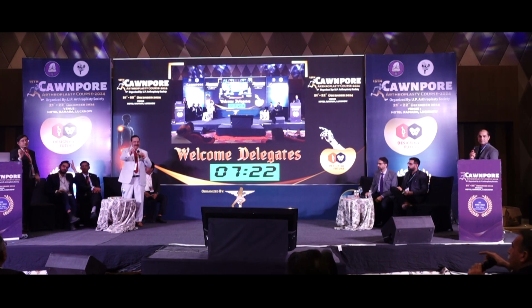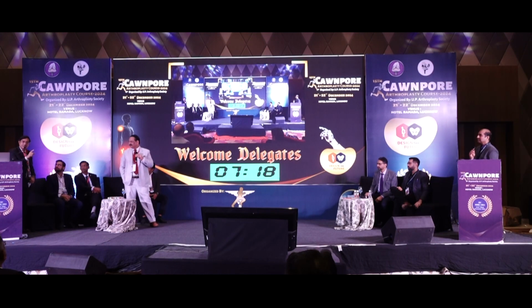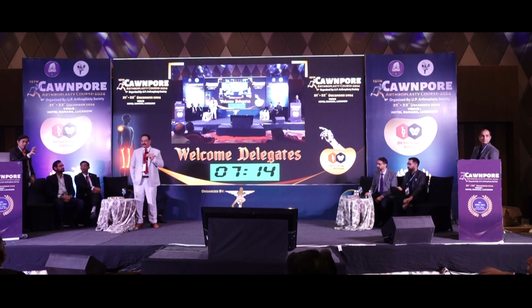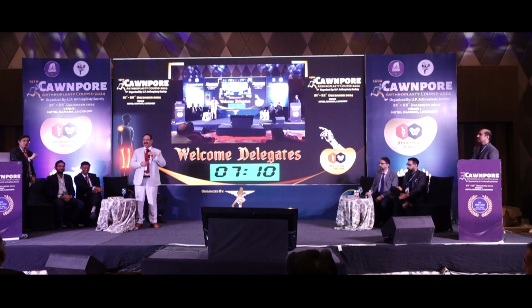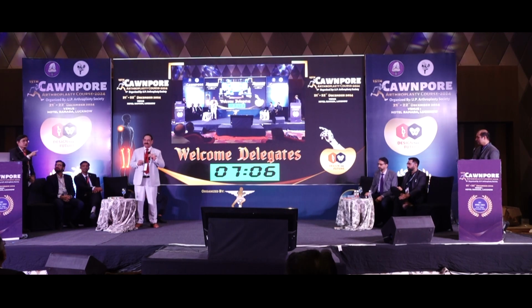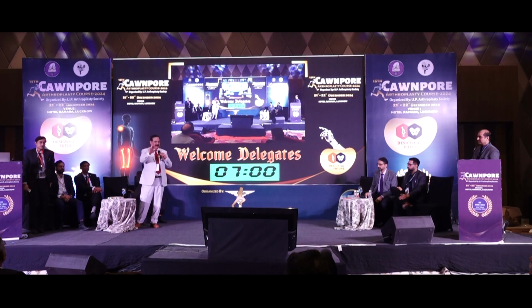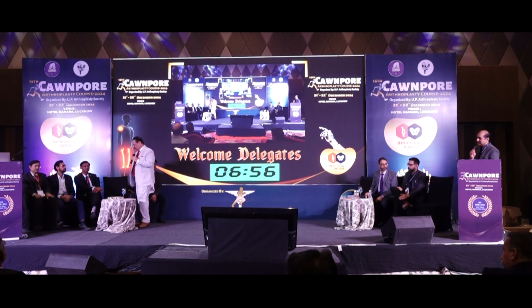You can do reverse reaming. See, what I do is, I impact it, then I do reverse reaming. It helps that graft to get set in its place. But the thing is that after reverse reaming, again I impact it. Because if you only do reverse reaming, the shear is not good for integration. You can use one size less trial and put it gradually. That works very well.